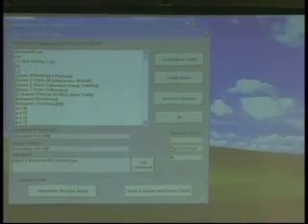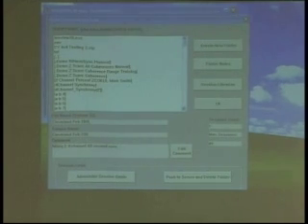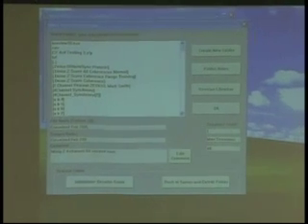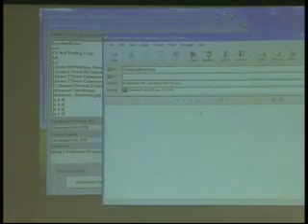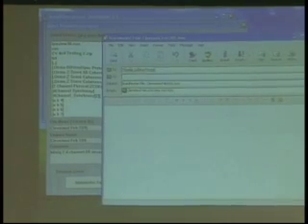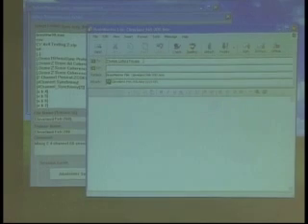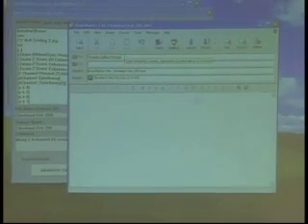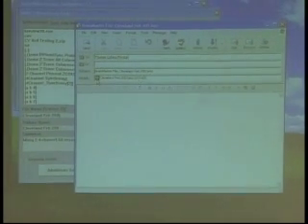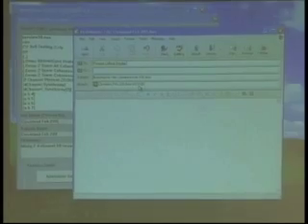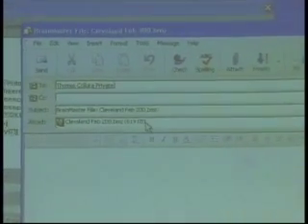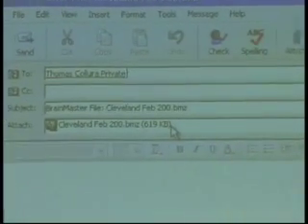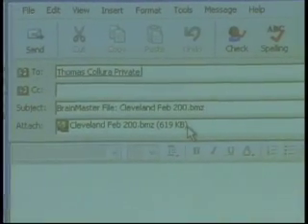Well, if I press Email, in just a moment, my computer wakes up its emailer. Lo and behold, it's already pre-addressed to me because I created the folder. And it contains the record here, the BMZ file, which is the entire training folder compressed.